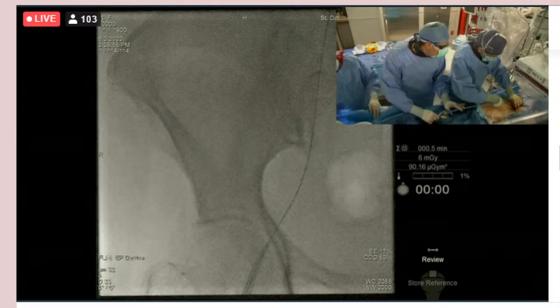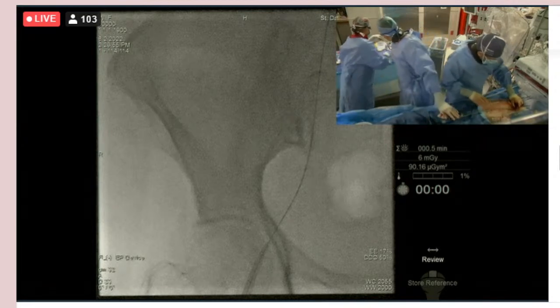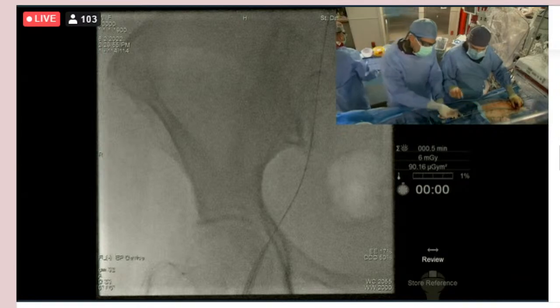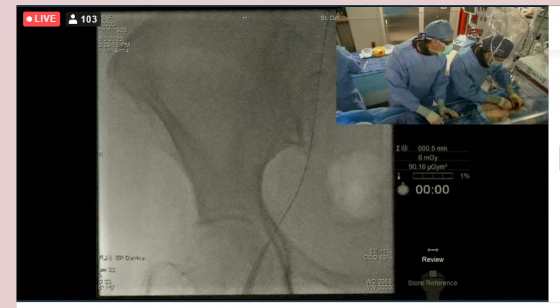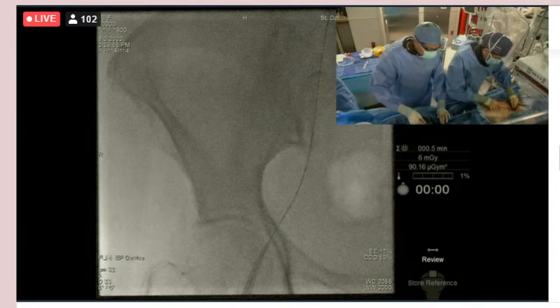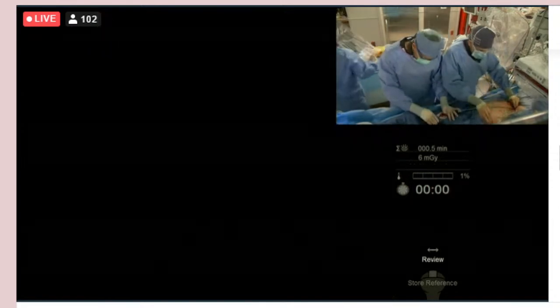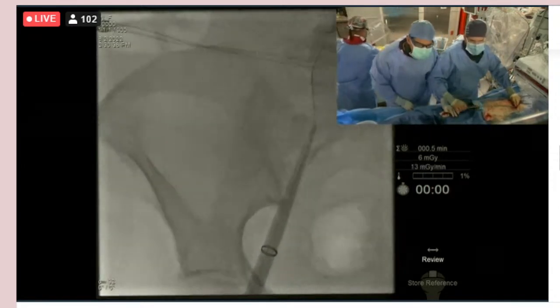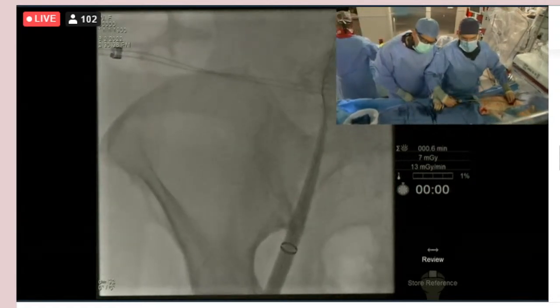One of the first ones we did, we struggled with because there ended up being a clot at the tip, and it took 7 deployments, couldn't get it. Then we pulled it out, and there was this clot adhered. But I think there's some variation in terms of heparin use. We've done a couple in people with thrombocytopenia that we've not given heparin. And the other thing is the sheath is very hydrophilic, so usually using a 4x4 or something gives some traction on it.